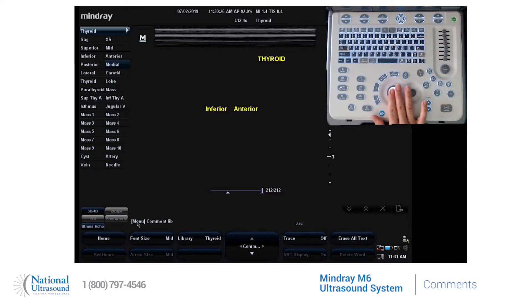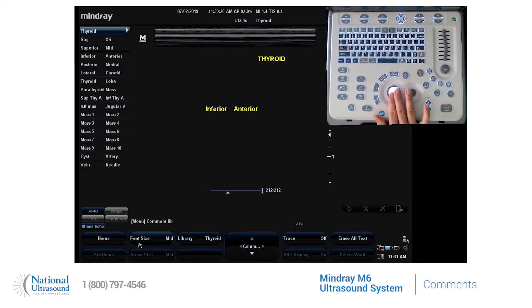You'll notice on the bottom of the scanning screen on the soft keys, they are now comment or text parameters.